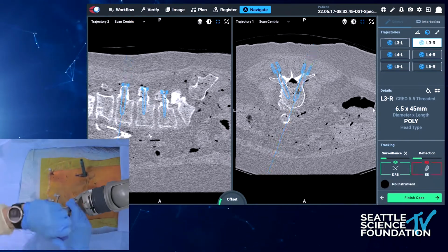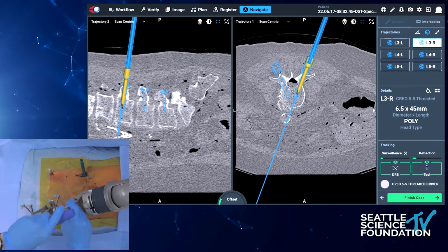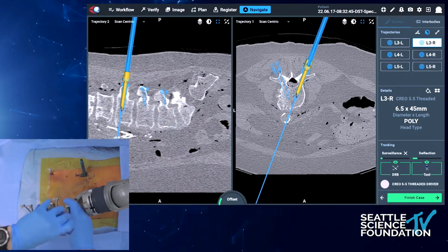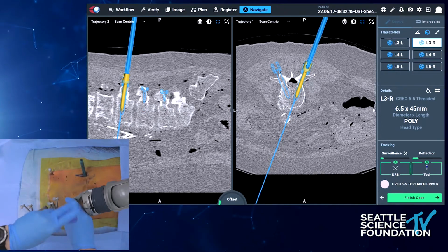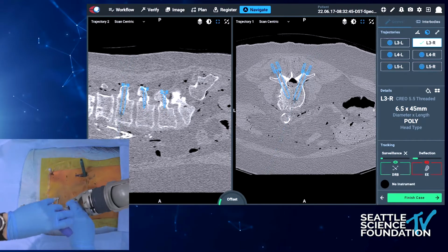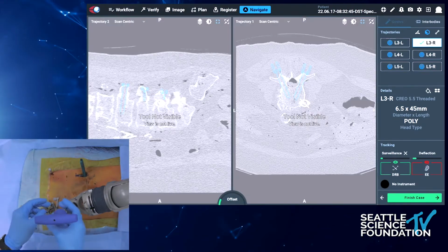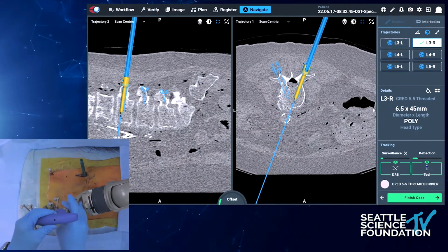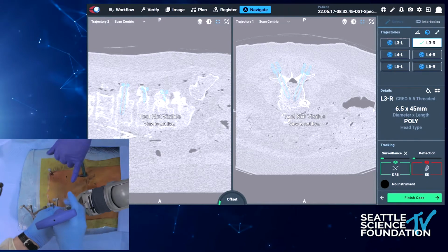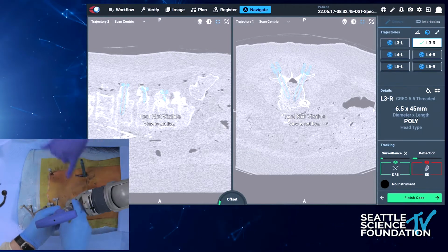And in so doing, improving the outcome, which we have plenty of data for in the literature with respect to minimally invasive surgery. It is not about the incision. Sometimes it's not necessarily about the dissection. There we go, perfect. When I do a T10 to pelvis, it is a significant reduction in my cognitive load over time. So he's demonstrating a nice little kind of troubleshooting.